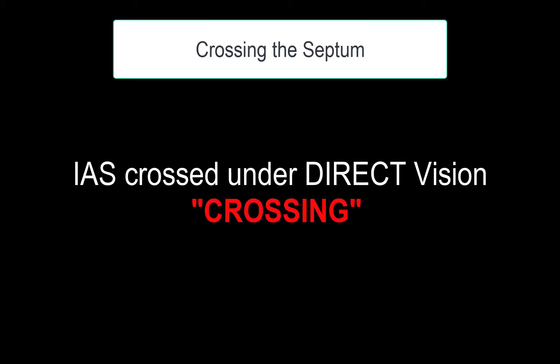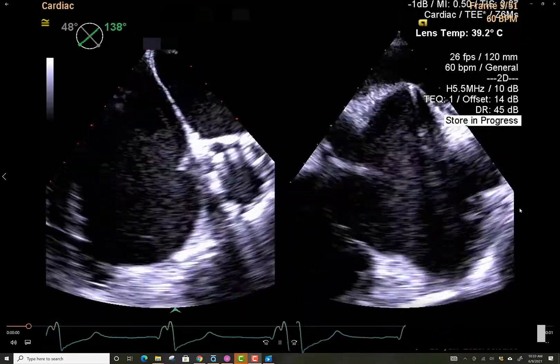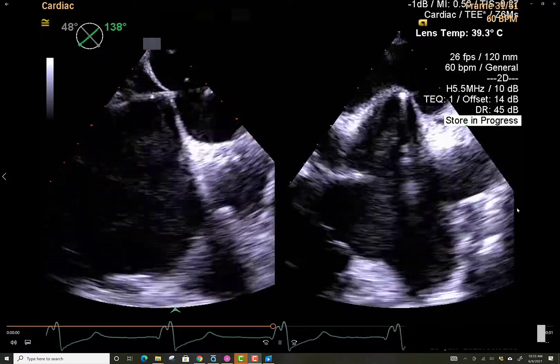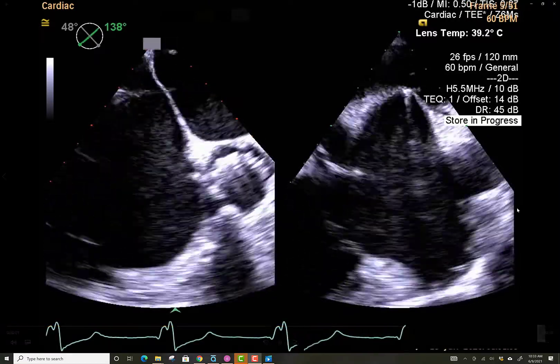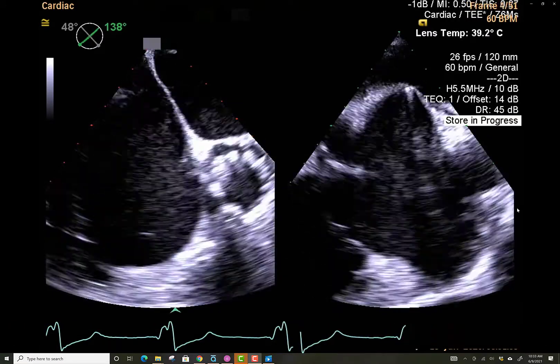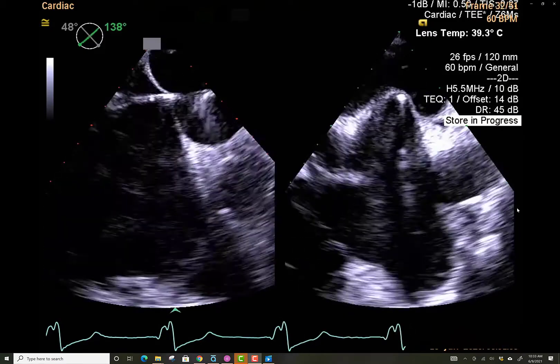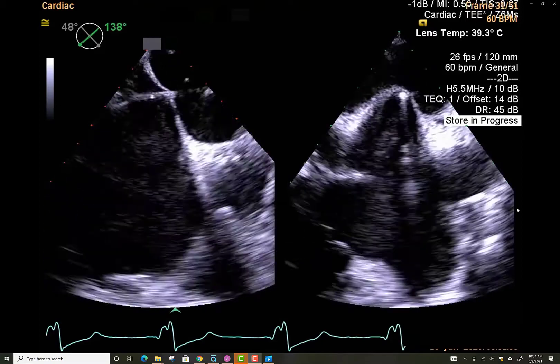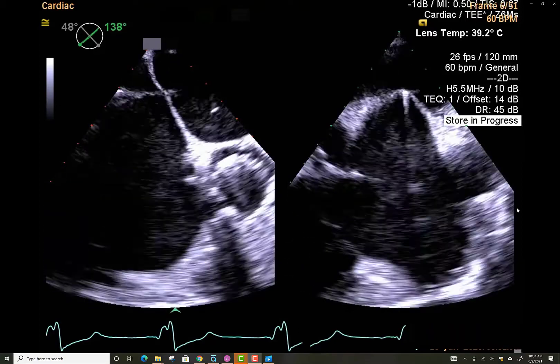At the final stage, the septal puncture is performed. The needle is visualized to puncture the interatrial septum and cross over from the right to the left side. There is considerable motion of the needle, and it is important to echocardiographically track this motion and confirm the needle position after crossing, confirming its presence in the left atrium.